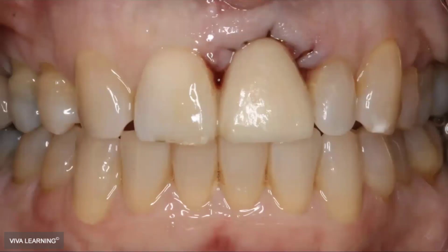So this person was bone grafted, and we did a Maryland bridge and E.max. There are stitches in there. That's probably not needed. That's a little overly precautious. But there are stitches and a collagen plug in there. But if your pontic is really well made and fills in the space, I certainly have done these without any stitches or collagen before.